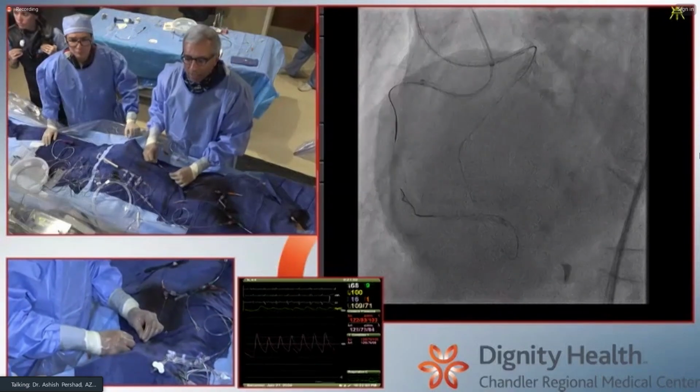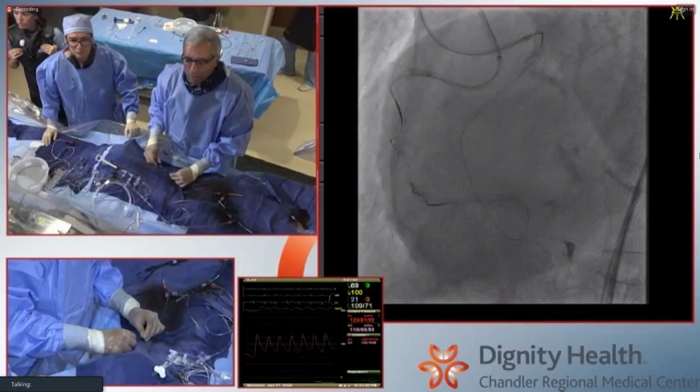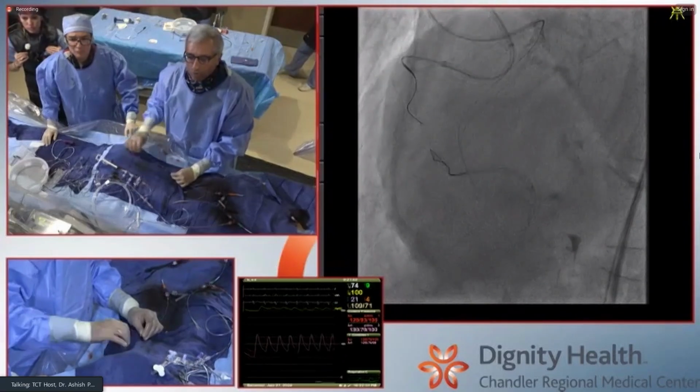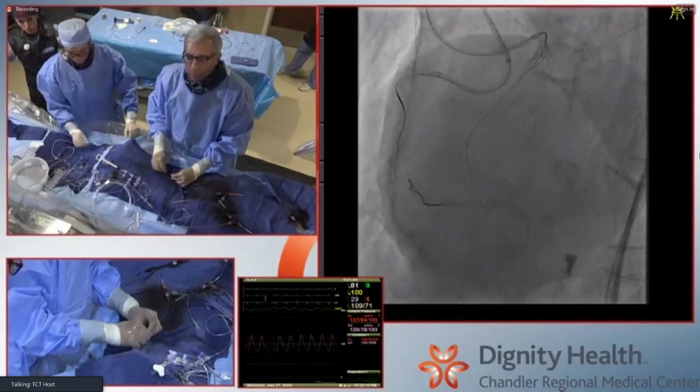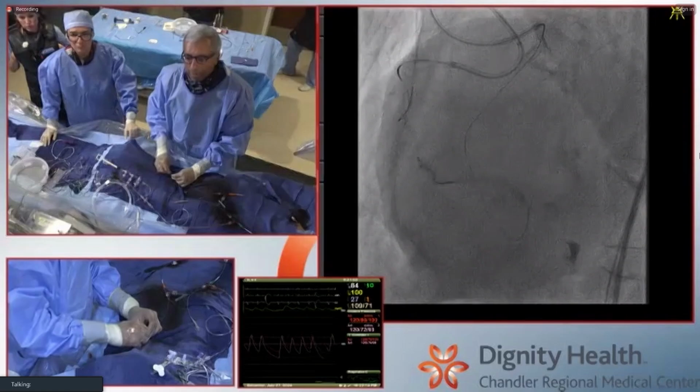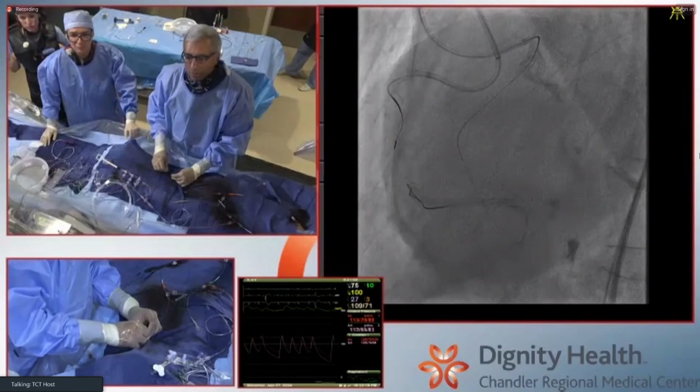As we talk about side branches, and there we go. Just look at that, making it fold and push back. Man, that's nasty calcium. That's exactly what we were thinking would happen. That's probably it. It's a Pilot 200 antegrade too? Yep.